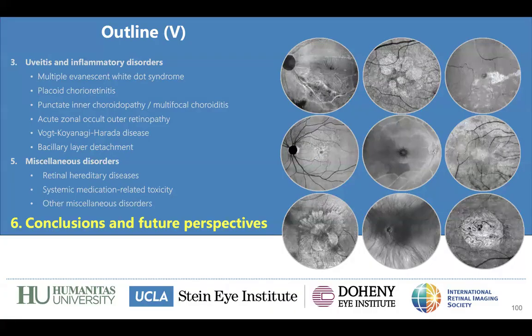I think it works a little bit better, but it was just a handful of patients that we tried. I'm curious to learn a little bit more about it, but I don't have that much experience with those OCTs. It's way too expensive so far.